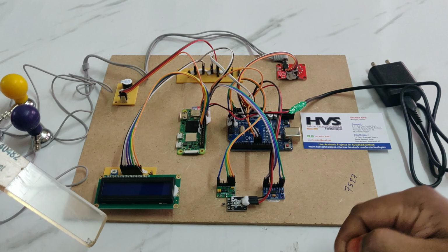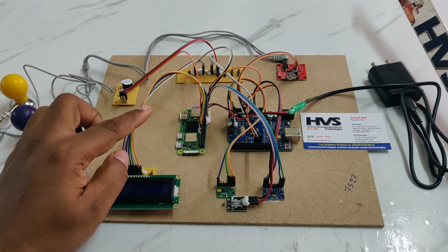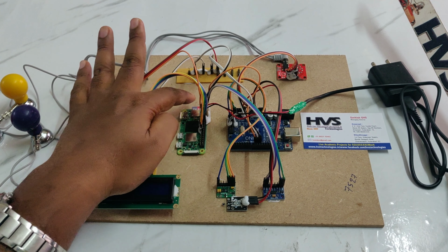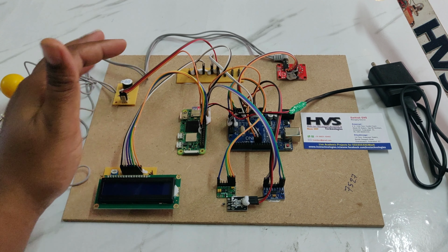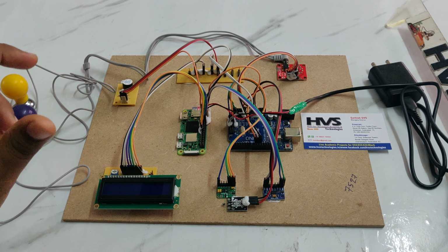Before inserting that, initially we need to load the Raspbian OS into it, and after loading the OS we insert that memory card here, connect the HDMI port, and turn on the power supply. There we can see the operating system on screen.